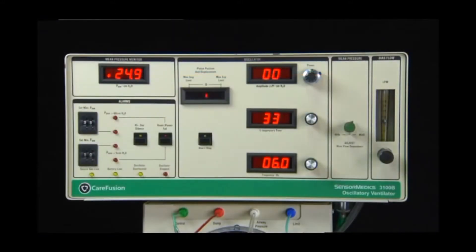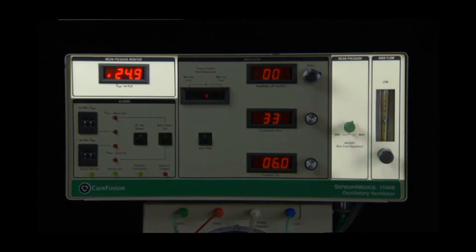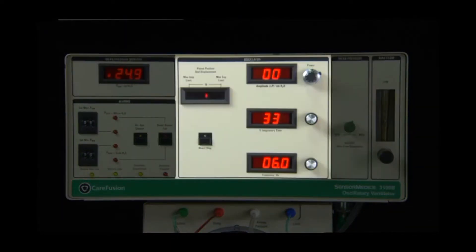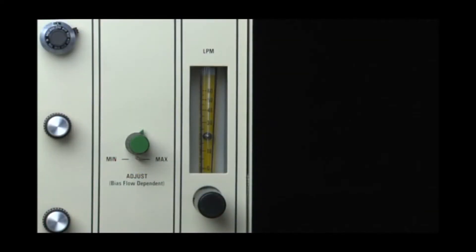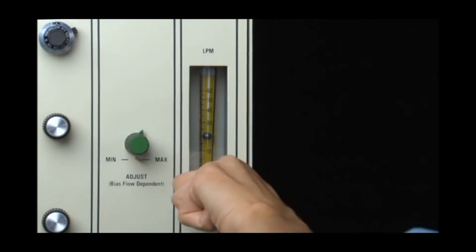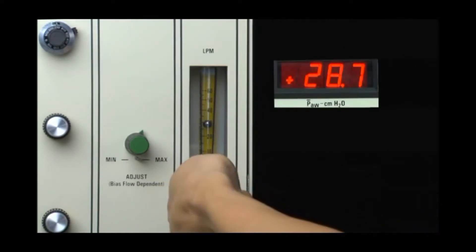The front panel can be divided into three sections: controls and displays for mean airway pressure, high frequency oscillation, and alarm package. The first control that is set when using the ventilator is bias flow. This sets the continuous gas flow through the system and is used to establish the mean airway pressure. Although the ventilator has a maximum flow rate of 60 liters per minute, typical applications of the 3100B use flow rates of only 25 to 40 liters per minute. Since the mean airway pressure is flow dependent, adjustments to the flow rate will affect the mean airway pressure range.